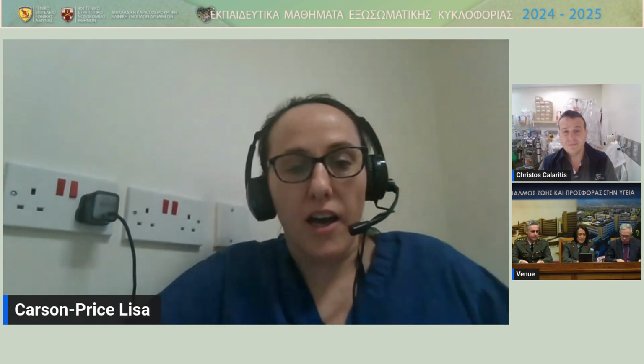I think the answer is it depends on the organisation setup. The role of the perfusionist in my organisation is we set up the ECMO circuit, we build the prime, put the patient on ECMO, transfer the patient back to the ICU, and then we hand over to an ECMO nurse specialist.